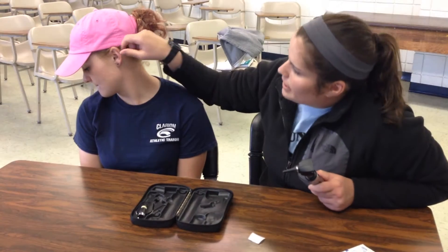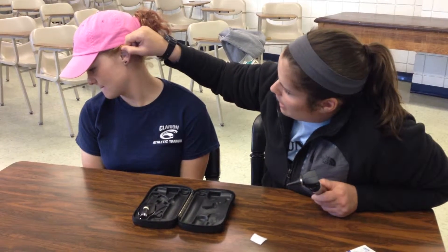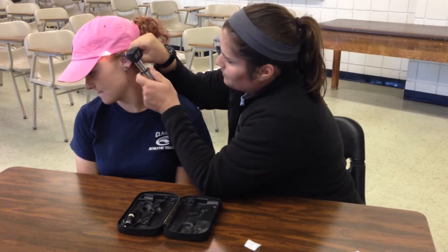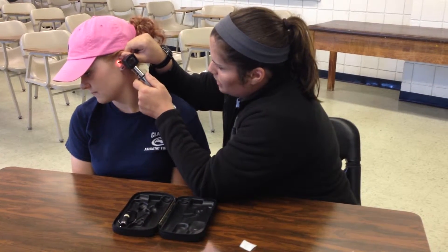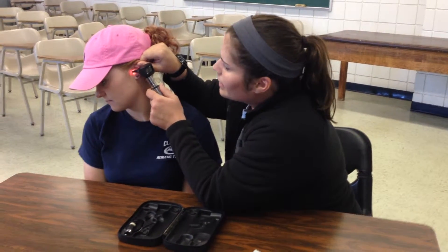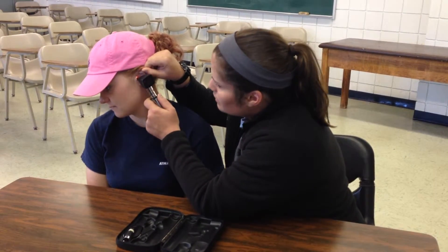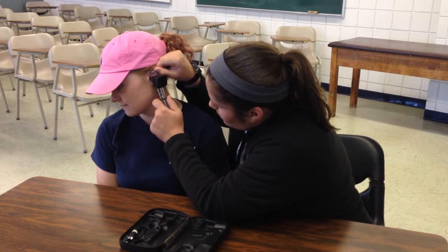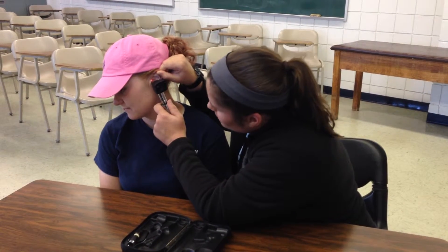We're going to start by instructing the patient to turn her head to the right and down. I'm also going to pull the pinna, which is the top of the ear, out and back. I'm going to rest the tip of the otoscope on the patient's anterior part of her ear, and I'm going to keep track of my patient to see if she's in any pain doing this.